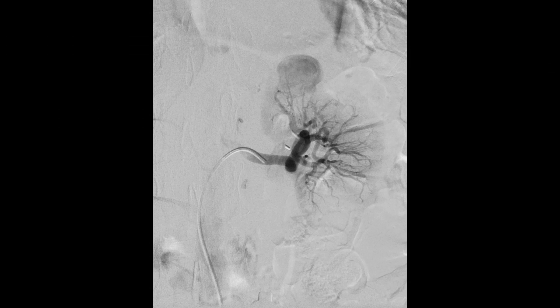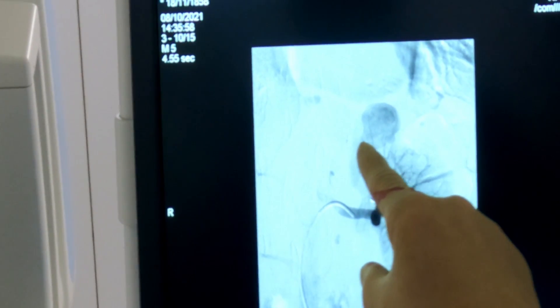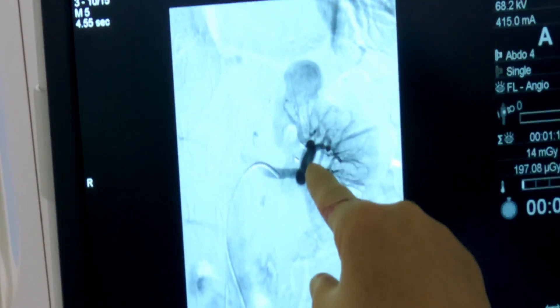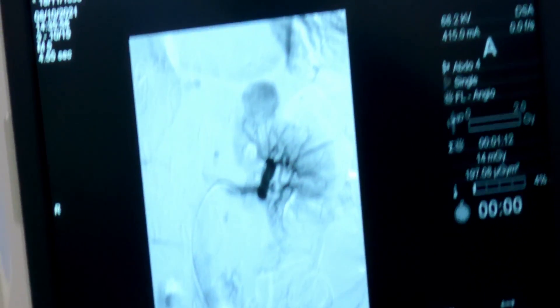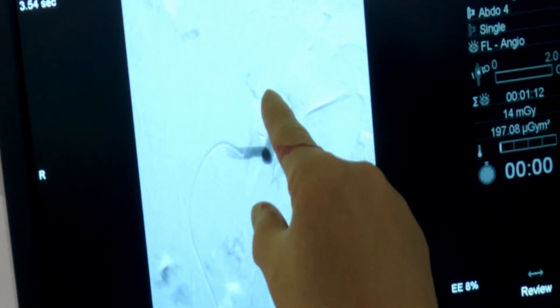Breathe away. Now you can see the pseudoaneurysm very nicely in the upper pole. It looks like it's coming from this vessel here, though it's hard to tell — typical renal arteries, you've got lots overlying. We could oblique, but actually the earlier image showed us our route through. Going back a couple of images — there — we need to come around there. So at this point we're going to go for a microcatheter.